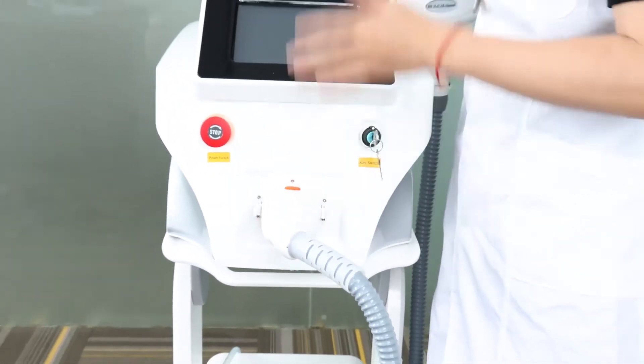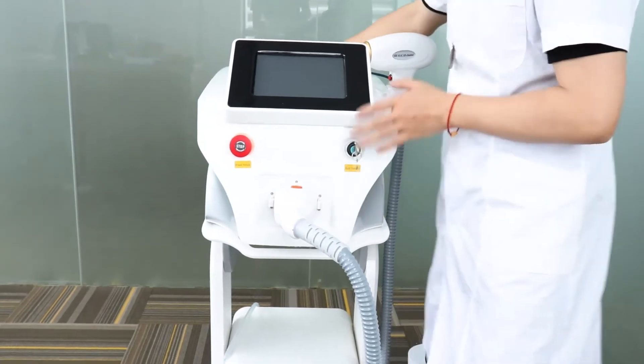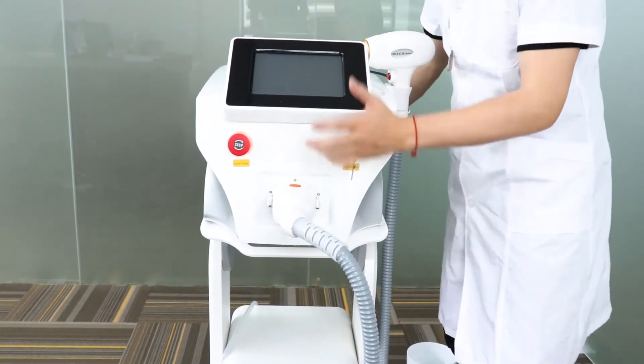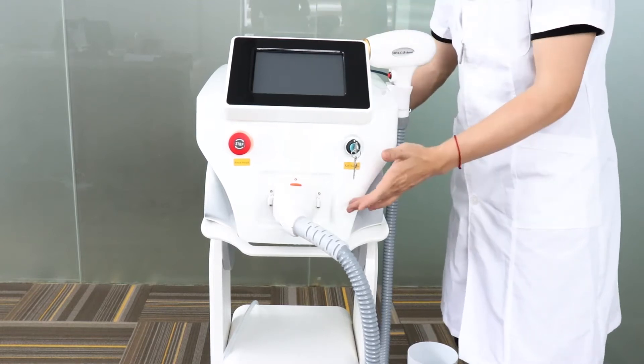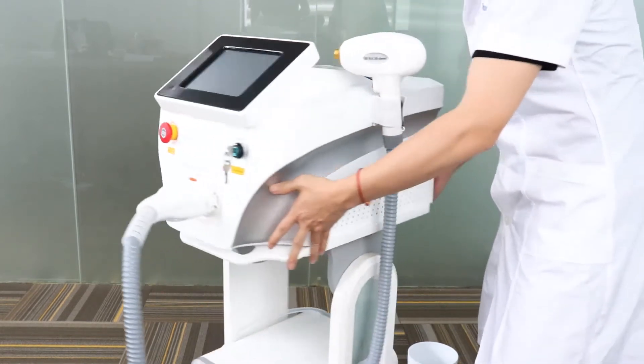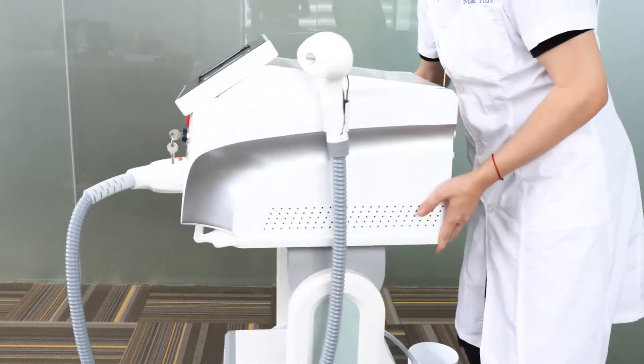Before you turn on the machine, the first step is done. The second step is to fill the water into the machine, because this is a water-cooling system. So now we turn it back — you guys turn it back.